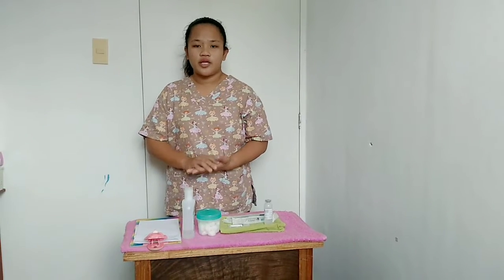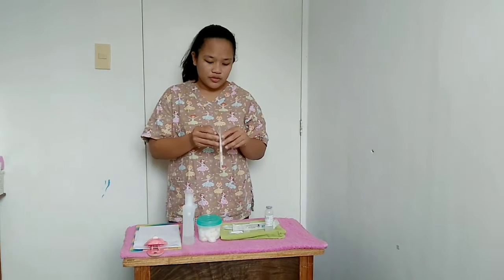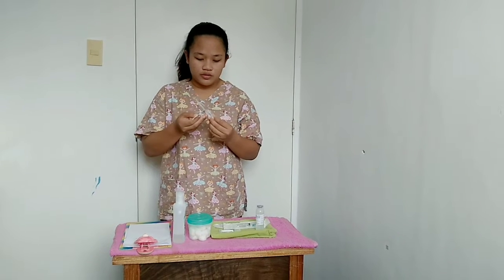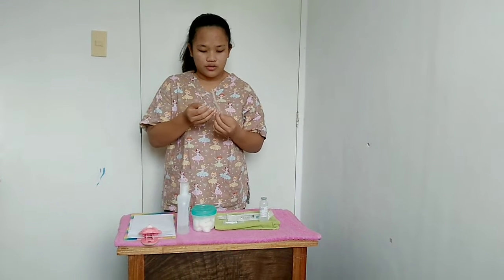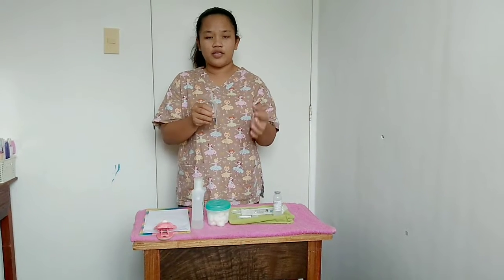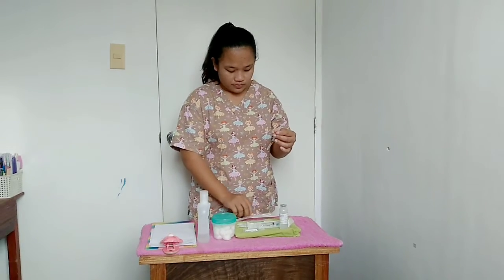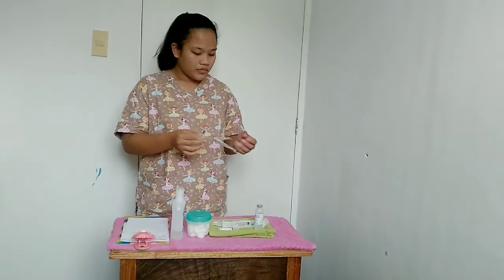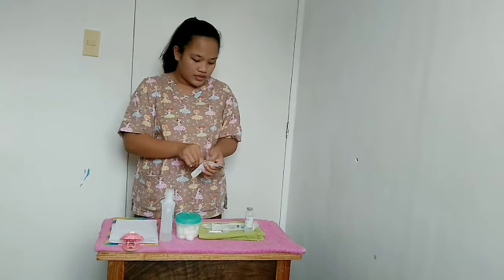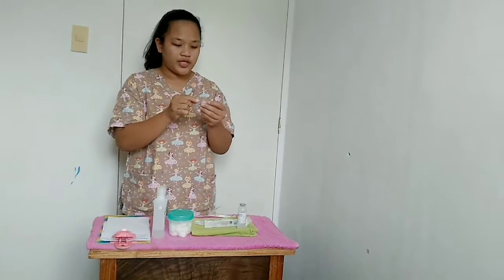To prepare the medication for intradermal injection, first we have to get the syringe and open the package. Always remember that we only hold the barrel and the plunger. We need to remove the needle and change it with the aspirating needle.